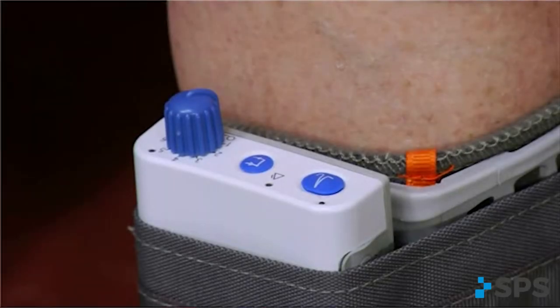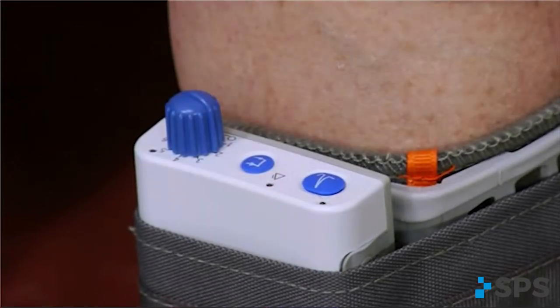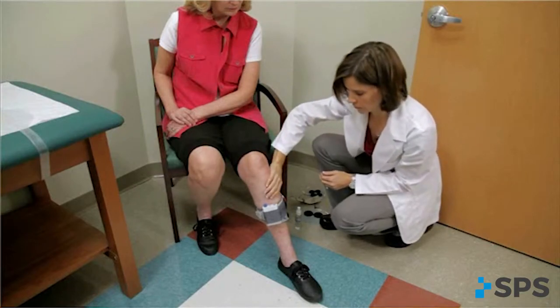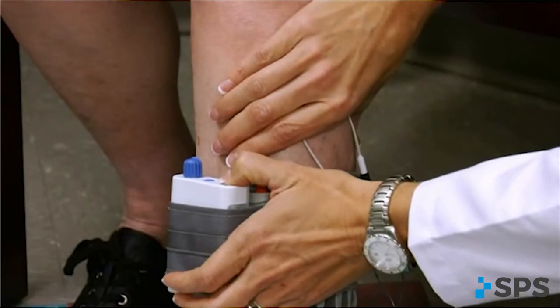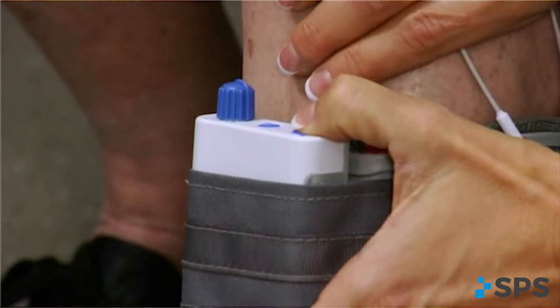Turn the walk aid on by turning the blue intensity knob in a clockwise direction to the one position. An audible beep will sound and a green light will flash intermittently to indicate that the unit is on. Always start at a low level of intensity and gradually increase during the testing procedure. Use the lowest intensity possible to get the desired response. Mimic the cuff with your hand. While maintaining total contact over the electrodes with one hand, press the stim button and observe the foot movement. The stimulation remains active for as long as you depress the button. Adjust electrode location to achieve optimal dorsiflexion as necessary.